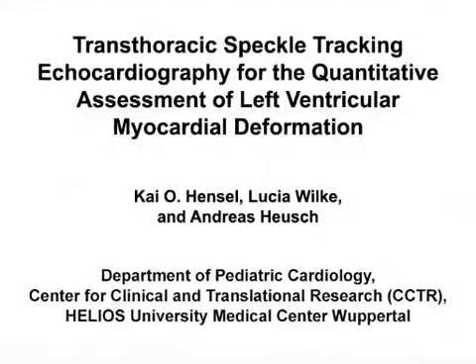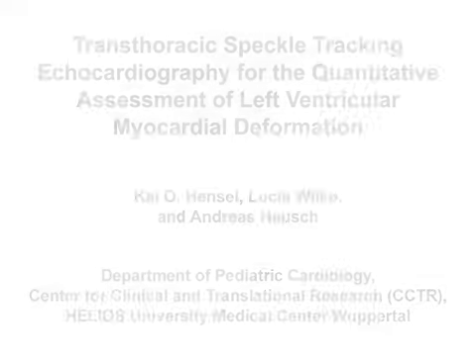The overall goal of this tutorial is to describe how transthoracic speckle tracking echocardiography is performed in a healthy volunteer. This method can be used to quantitatively assess both segmental and global myocardial deformation.